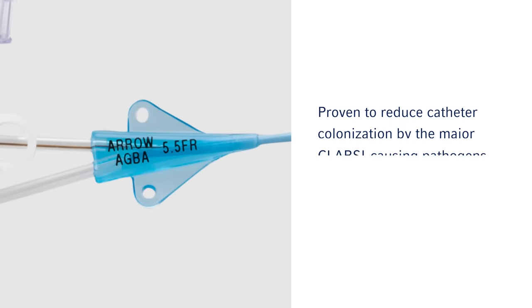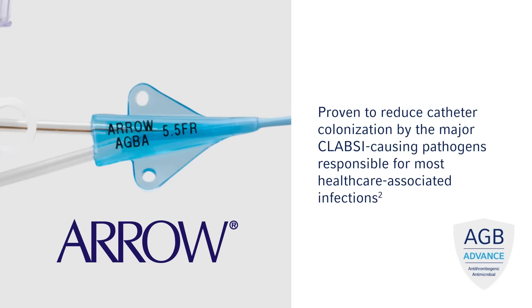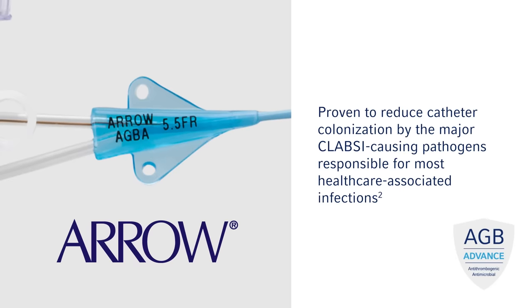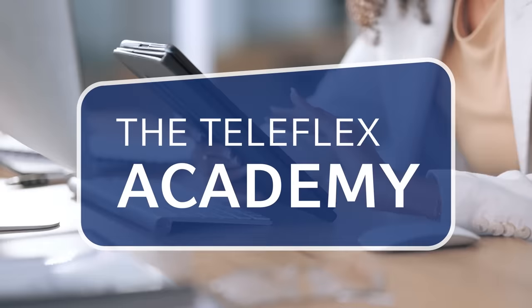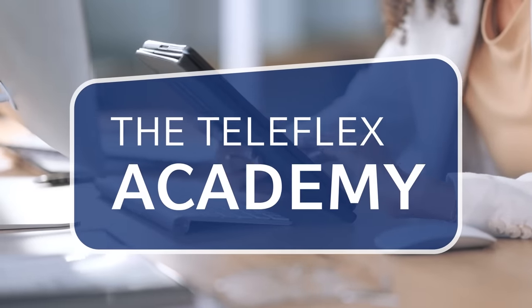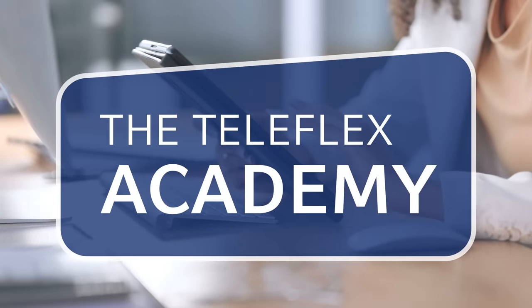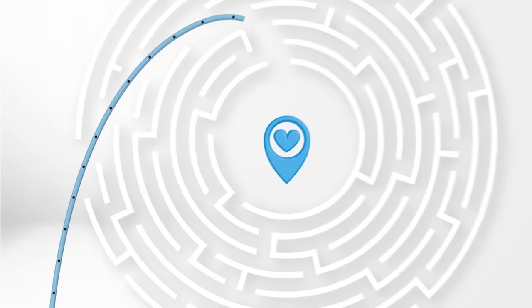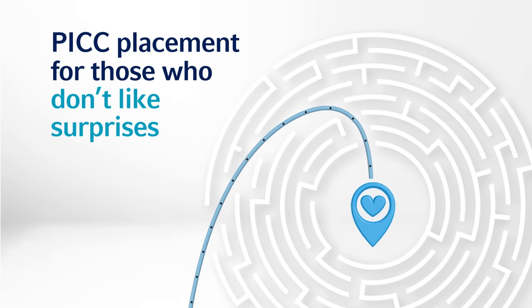Teleflex offers the only PICs protected with ArrowGuard Blue Advance antimicrobial and antithrombogenic technology to enable even greater patient safety, as well as best-in-class customer service and educational resources from a trusted vascular access partner. When it comes to PIC placement, for those who don't like surprises, count on the precision and predictability of the Teleflex vascular access suite of products.